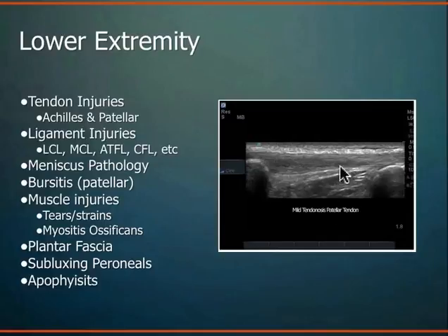This is that retropatellar area where you have the fat pad and a bursa, and you can see the anatomy quite well. You can see LCL quite well. You can see MCL quite well. You can't see ACL, PCL. Again, limitations of your modality and knowing what you can use it for.